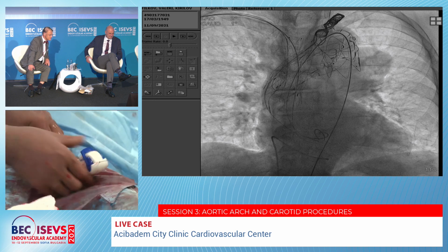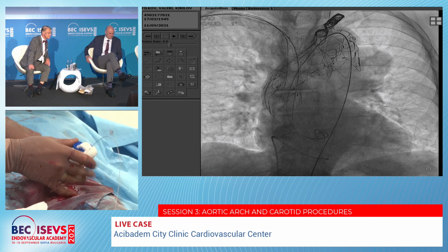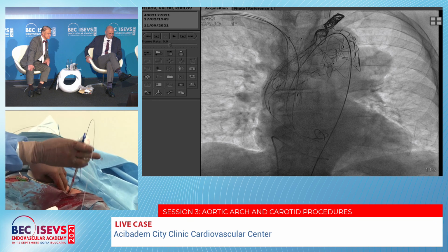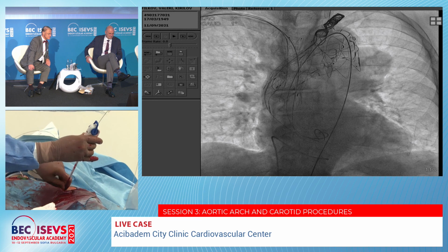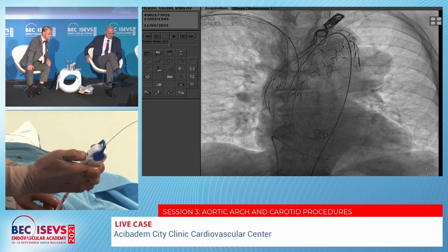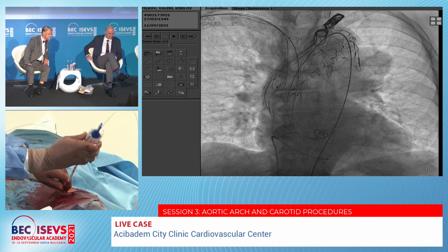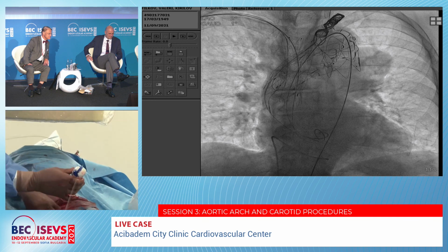We have measured in advance the level of opening the plug inside the artery. It's 5 centimeters in this case. So we are now anchoring because we have here a red marker. I'm waiting a little for the collagen of the outside anchor to activate. And finally, we make push-pull.